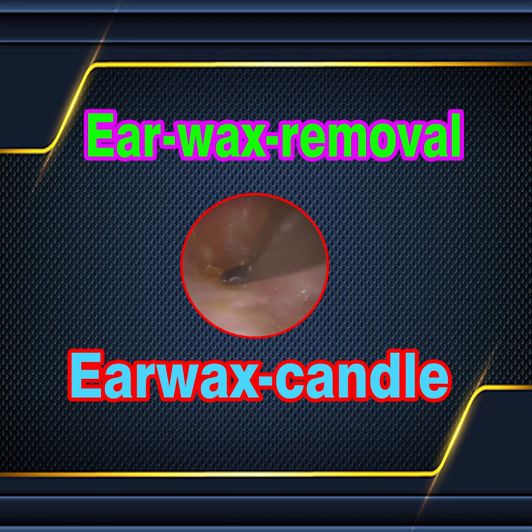You've got to be prepared when the Curette is no longer underneath the skin, because that force, that pressure you're applying, then means that when the Curette leverages over the dead skin, there's no support for it. It can just flare in the ear and hit the delicate structures. So you can see that's just helped with this skin at the bottom as well. So sometimes around your ear canal, just encrusted bits. If it's coming away, brilliant. If not, I'm not too concerned by this. This isn't the sensitive part of the ear, but because it's quite crusted, I had something to leverage onto there.